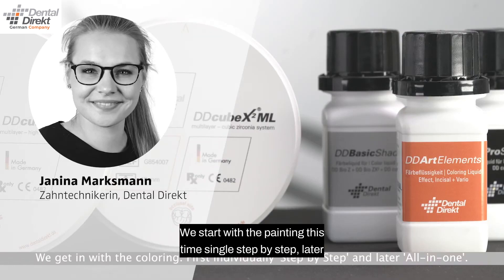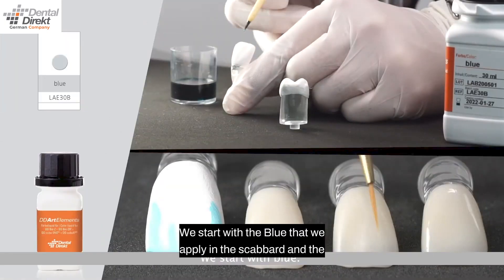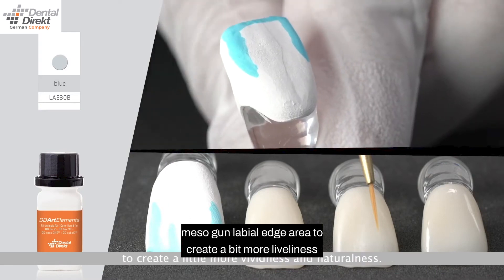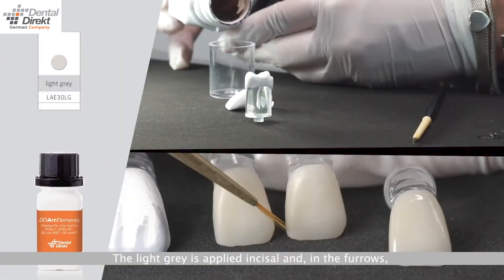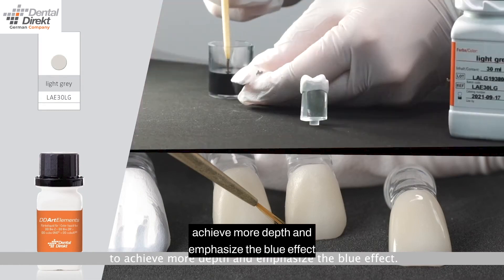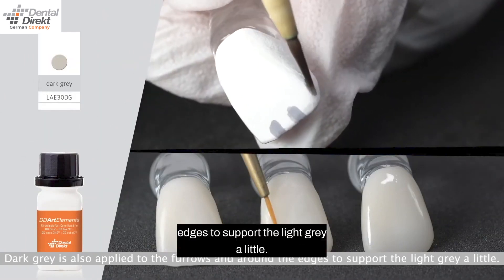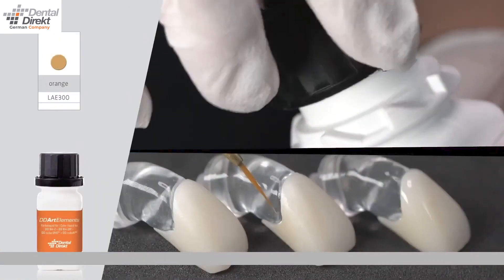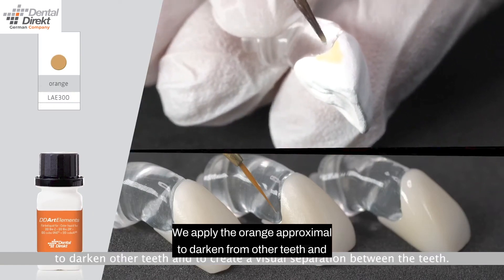We start with the painting this time step by step, then all in one. We start with the blue, applied in the incisal and the mesial labial edge area to create a bit more liveliness and naturalness. We apply the purple in the labial edge area to darken and to achieve more depth. The light gray is applied in the fissures to achieve more depth and emphasize the blue effect. Dark gray is also applied to the furrows and around the edges to support the light gray. We apply the orange proximally to darken from adjacent teeth and to bring about an optical separation between the teeth.